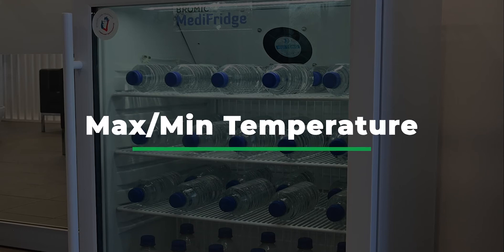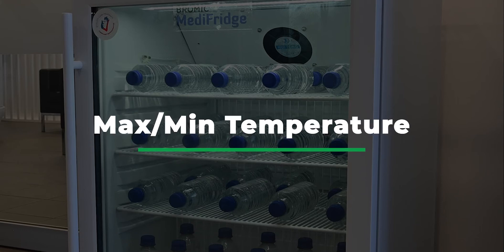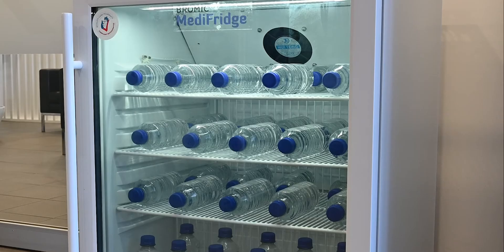Using the maximum and minimum temperature record. As a standard feature of your Bromic Medi-Fridge, it will record the maximum and minimum temperatures. Depending on how the unit is being used, you may need to record these temperatures over a given period of time and reset if necessary.